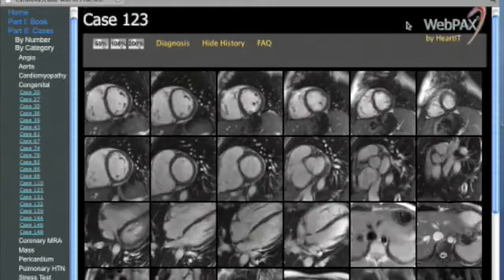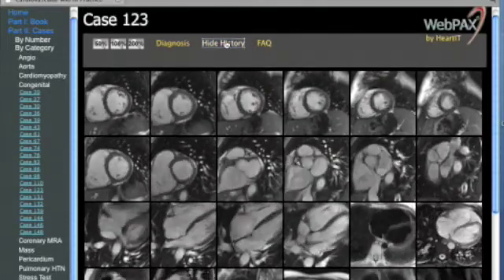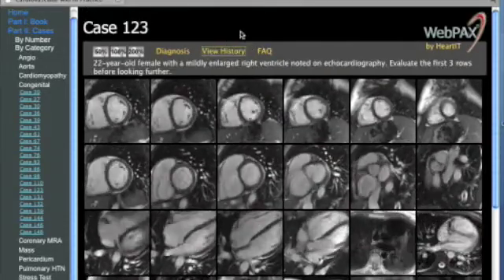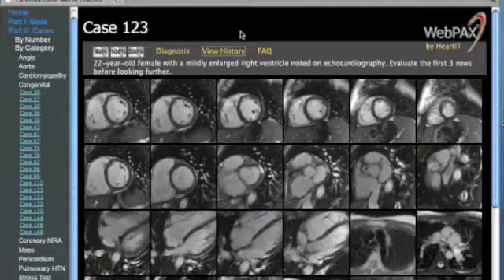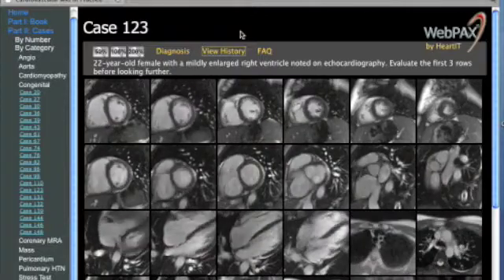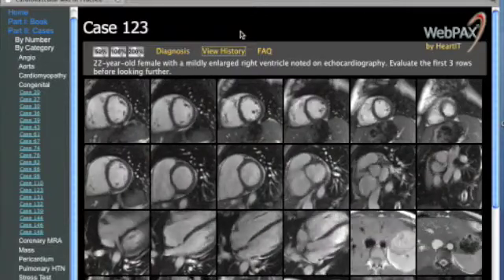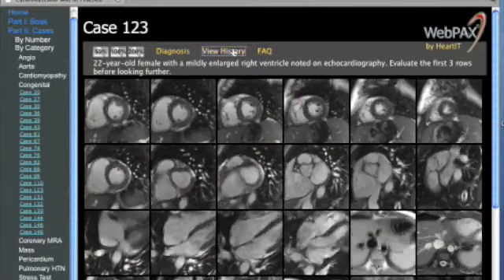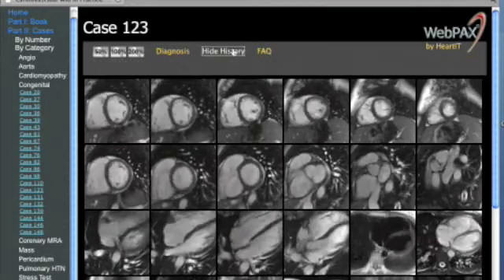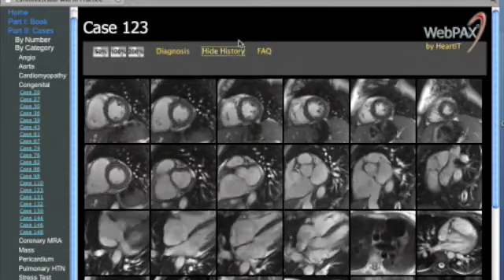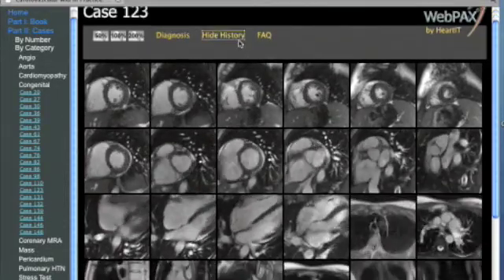The next case is a congenital case. The history is a 22-year-old female with a mildly enlarged right ventricle noted on echocardiography, and it is suggested that the first three rows be evaluated prior to going further.